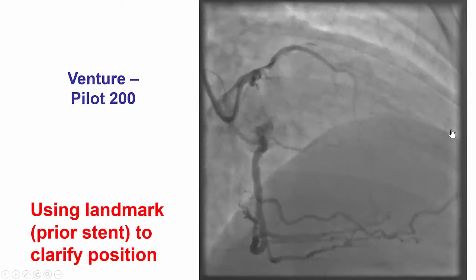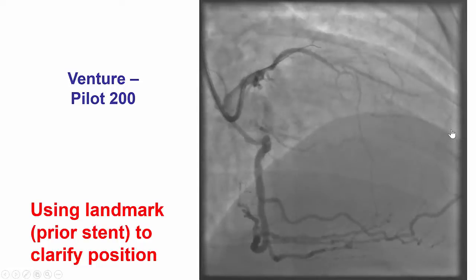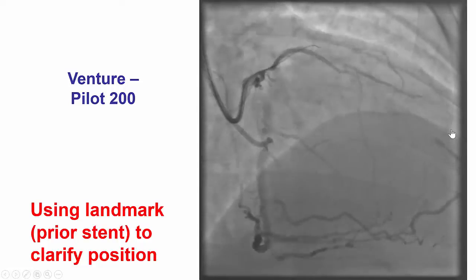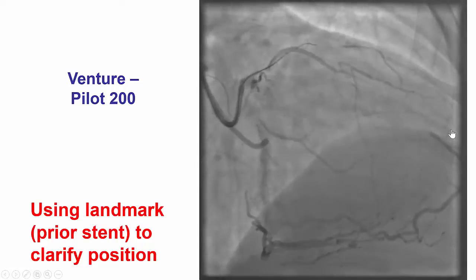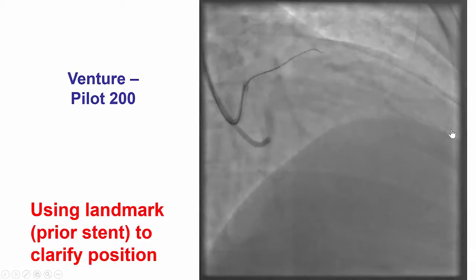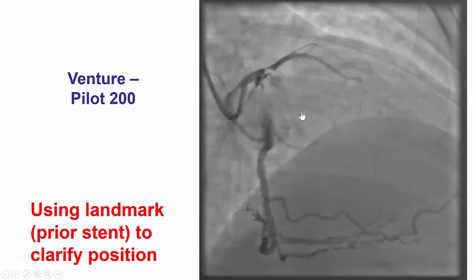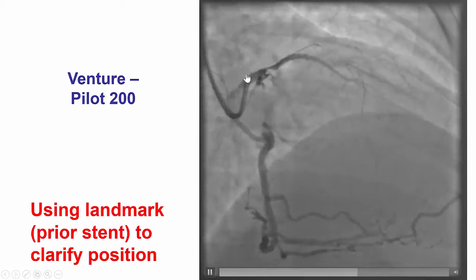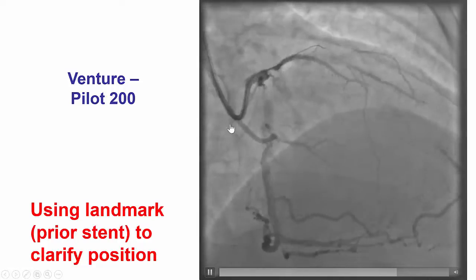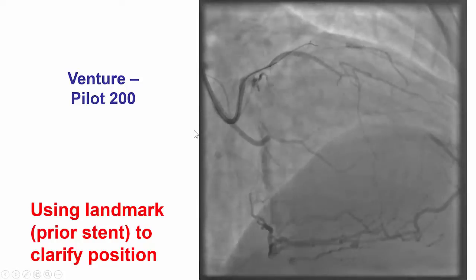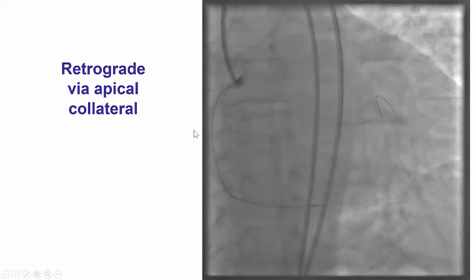Several attempts were made antegrade to cross using the previous stent as a marker; however, the wire was clearly outside the previous stent. Therefore, we quickly changed to a retrograde approach.